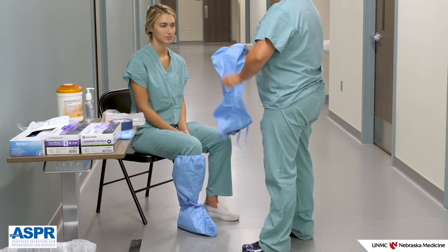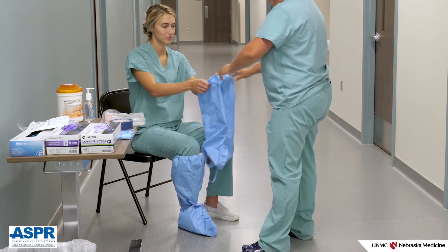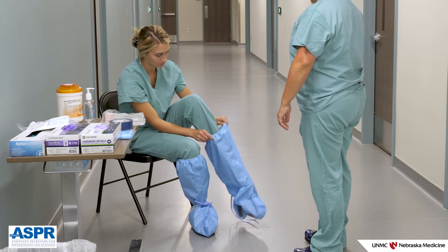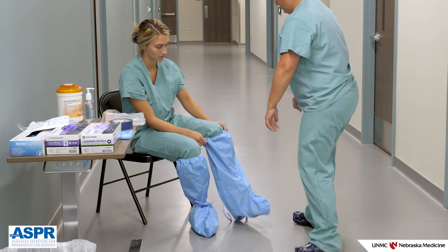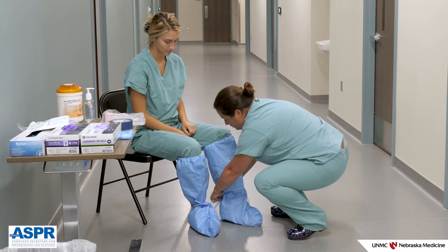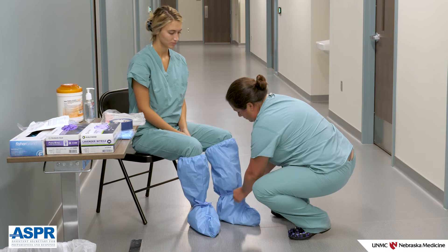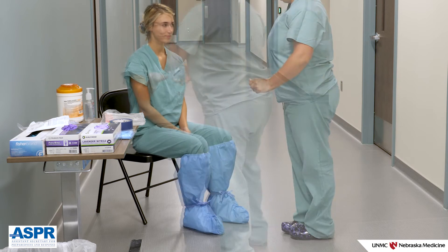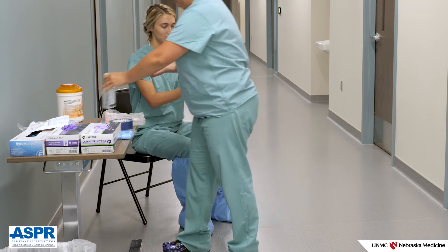Boot covers are the first item to be donned. We recommend sitting on a chair to don your boot covers — you will be less likely to fall or cause your boot covers to tear while donning if seated. If present, ankle ties should be tied in an easy-to-undo bow, as this will facilitate ease of doffing. Perform hand hygiene.